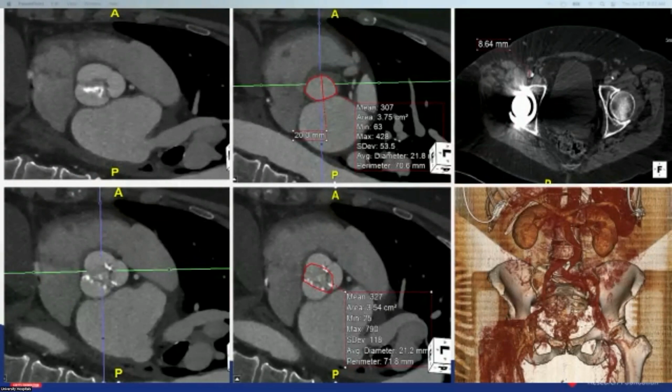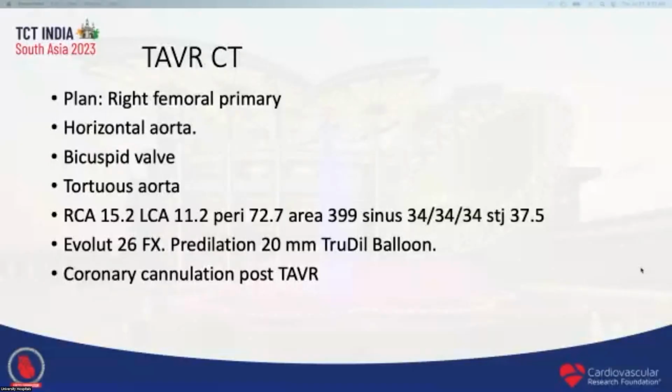Go to the next slide, please. Because in India, FX availability is an issue, if we are performing the same case in India, would your choice still be a self-expanding valve? I would do what Sushil suggested. Yeah, I think you can do self-expanding.